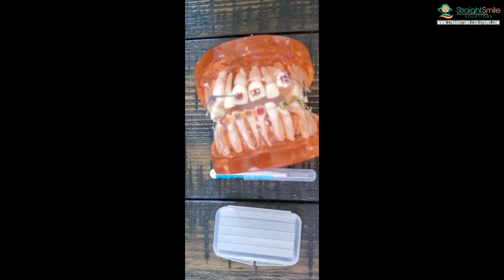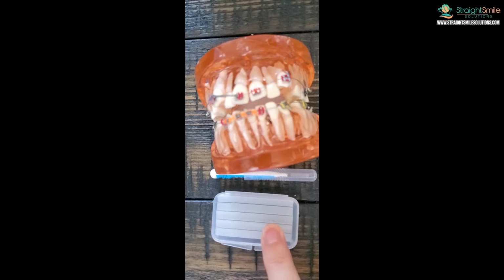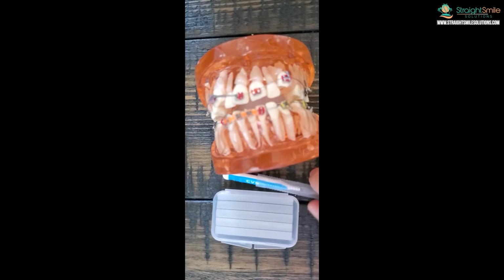That one actually sticks better, and it lasts longer. This is just your traditional beeswax. This one is cheaper. It's okay if you swallow it, but just letting you know there's other different types, so you want to find the right one for you. So wax is the most critical. So let's start with wax, because wax is your best friend.